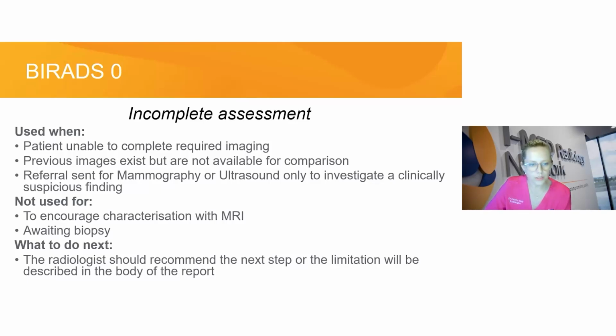So the third option is if a referral is sent for only mammography or only ultrasound to investigate something that is considered clinically suspicious. And in those circumstances, we can't make a judgment, and that report will come with a recommendation. So as I've said in what to do next, if you get a 0, you really should have a next step identified for you as to what you should do and what the limitation is, if we can overcome it or not. We don't use it to encourage characterization with MRI.